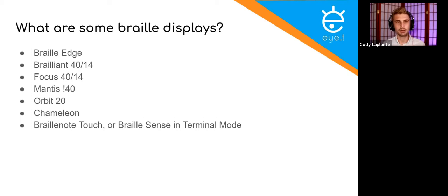Now, if you're thinking, oh, I use my BrailleNote Touch and I log on and I use KeyWord and KeyMath, that's not what we're talking about today. We would call that a Braille note taker. What I'm talking about is taking a Braille display, something that doesn't have an operating system, is not its own computer, and hooking it up to your computer and using it with a screen reader. So that's what we're talking about today.